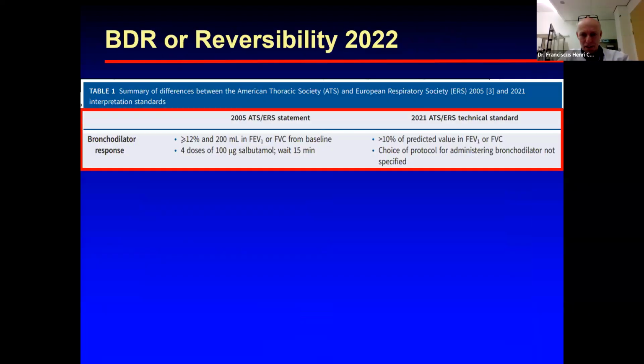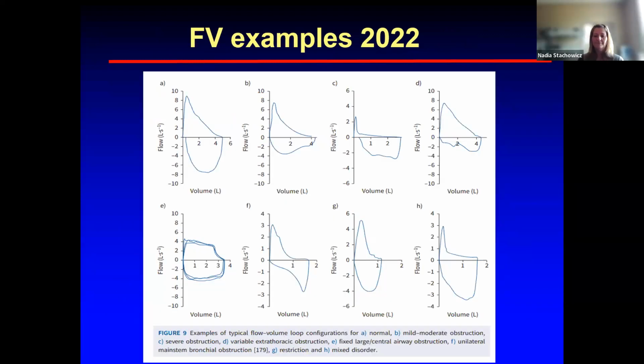Yeah, I think almost there. Here we are. This one, yep. What you can see is, which is, let's say, not often occurring, but number D can occur. In number D, if you go for the FEV1 and the FVC, and only look at the blue bullet points and the Z-scores, and you don't look at the peak inspiratory flow, you make the mistake that you think this person is healthy, while they are not, because the inspiration is not high enough.